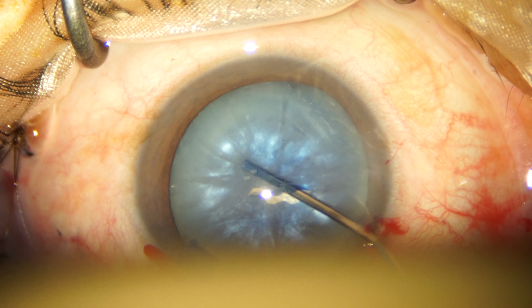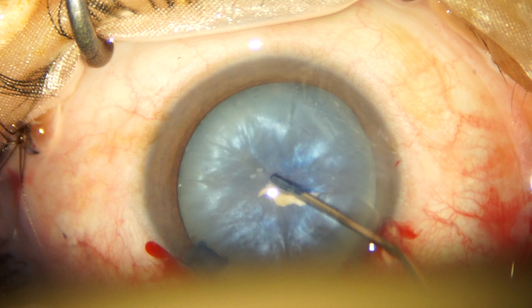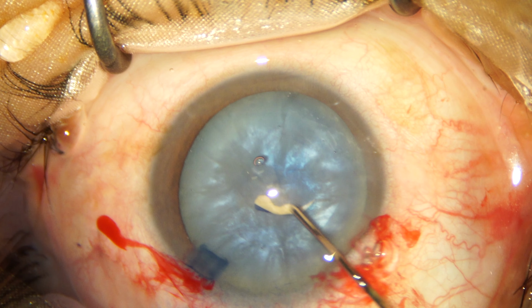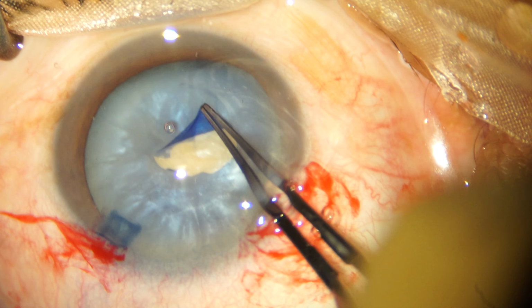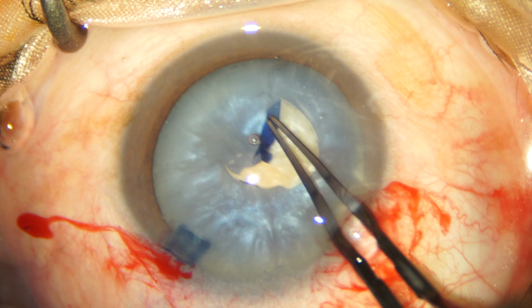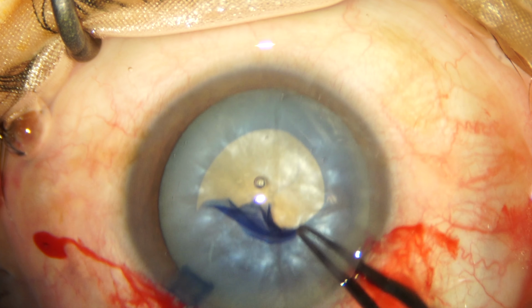So I'm aspirating some of the liquefied cortex with a 27 gauge cannula to reduce the intumescence of this mature cataract. And again I flatten the anterior capsule with a cohesive viscoelastic and begin my capsulorhexis with the Utrata forceps. These measures were taken to prevent any radial extensions of the capsulorhexis, as is often seen in mature intumescent cataracts.